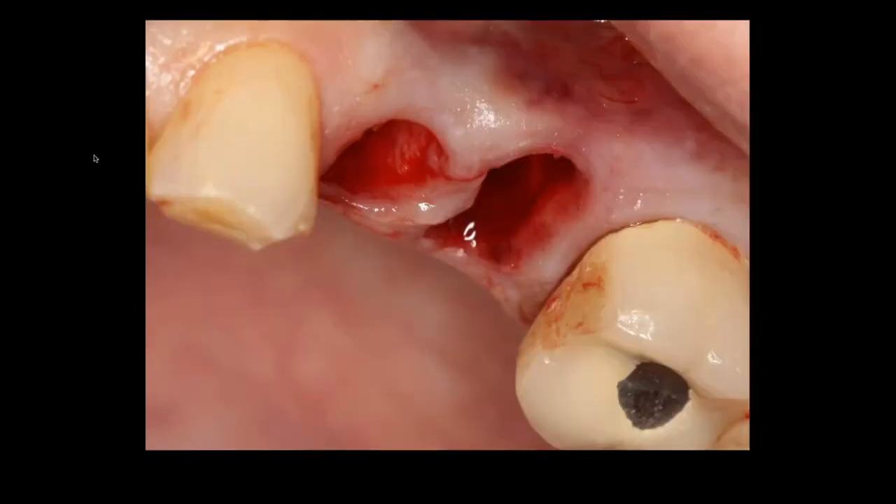We evaluate the socket sites by curetteting thoroughly. In this situation it was determined that we do not have a facial plate of bone — I did not damage it, it had simply melted away due to fracture over time. We take a radiograph to confirm the roots are removed in total.